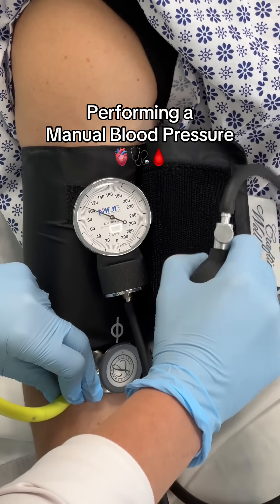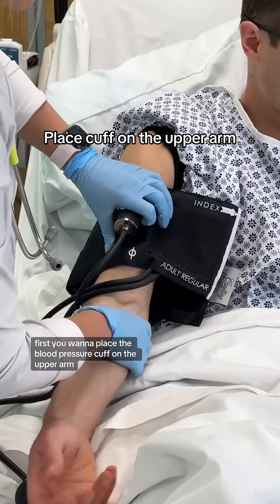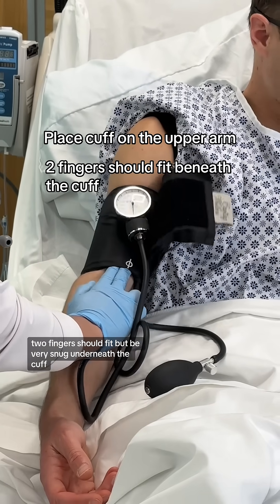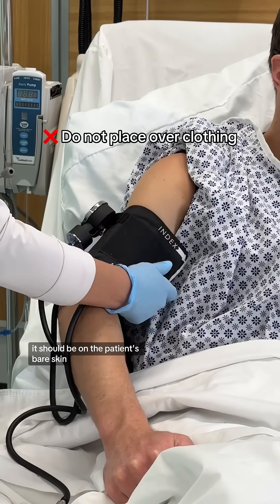Steps to performing a manual blood pressure. First, you want to place the blood pressure cuff on the upper arm. Two fingers should fit but be very snug underneath the cuff. You don't want to place the cuff over clothing — it should be on the patient's bare skin.